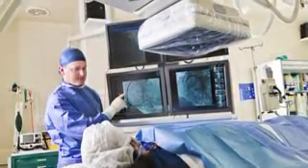This test is called a coronary angiography. The dye can show whether a waxy substance called a plaque has built up inside of your coronary arteries. Plaque can narrow or block the arteries and restrict the blood flow to your heart. The buildup of plaque in the coronary artery is called coronary heart disease or coronary artery disease. Doctors also can use ultrasound during cardiac catheterization to see blockages in the coronary arteries. Ultrasound uses sound waves to create detailed pictures of the heart's blood vessels.